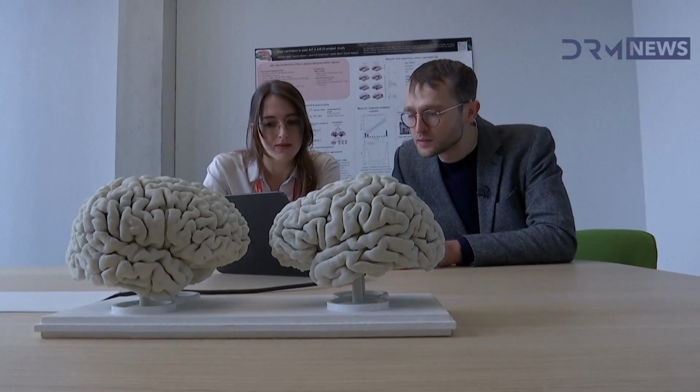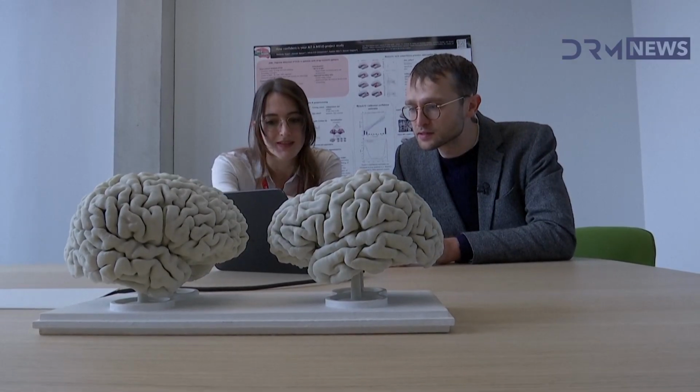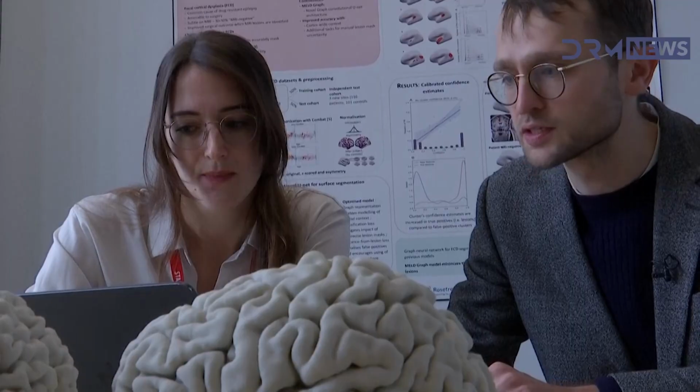I think actually you can weirdly see the transmantle on the T1. Yes. But I think with prediction.